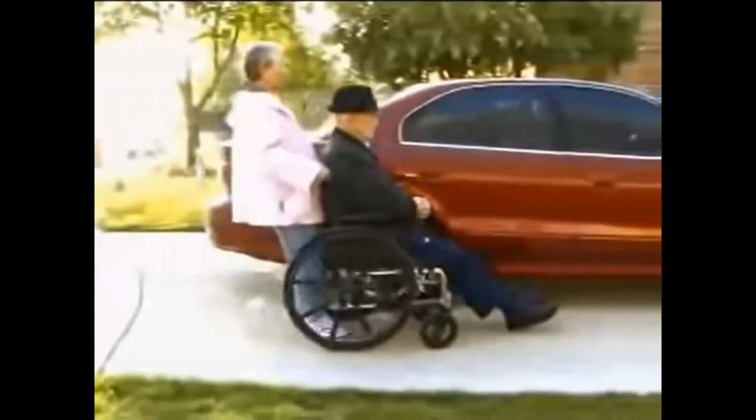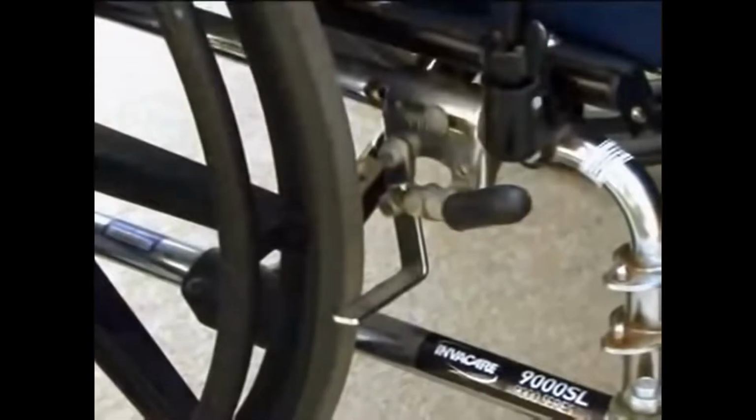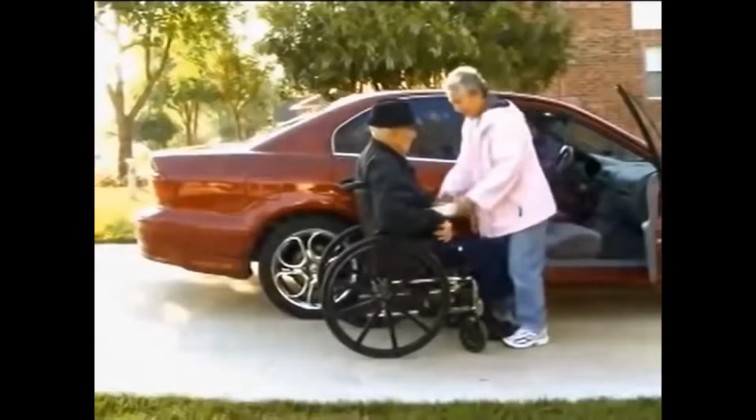Before starting the transfer, open the door, place the wheelchair at an angle and as close to the car as possible. You should lock the brakes for safety. This will stop the wheelchair from rolling away when your loved one stands up.